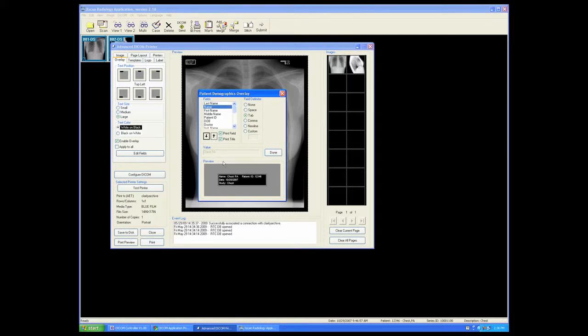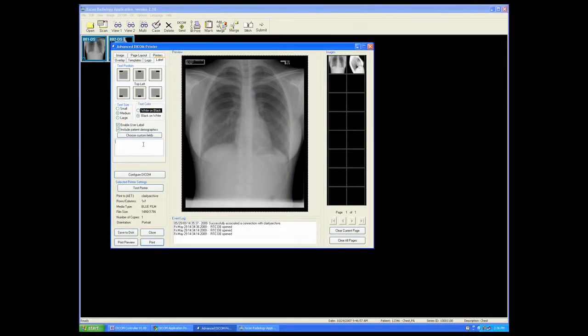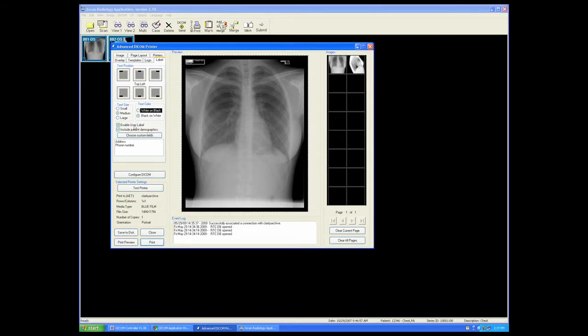We can also label the image with the address and data of the facility, such as an address and phone number. We can choose, again, white on black, black on white, and we can choose the location of that label.